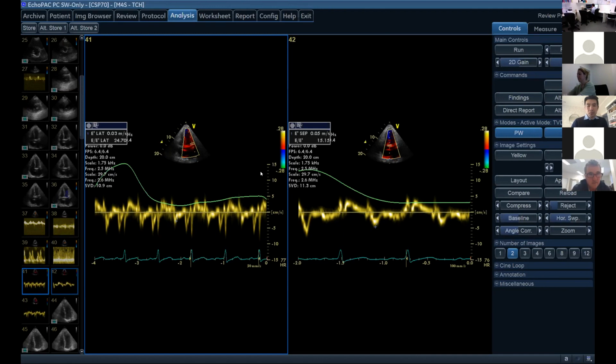So the big features that you're looking for in constrictive pericarditis are, first of all, some risk factors. Second of all, some shortness of breath. Third of all, on echo, you're going to see that ventricular interdependence with respiration. It's very important with respiration. And then the last thing you're going to use is the big pathognomonic one here, which is annulus reversus, where the medial is higher than the lateral, and I'm talking about the E prime. That's because, as Louise was saying, the lateral area of that heart is tethered. So annulus reversus equals constrictive pericarditis.